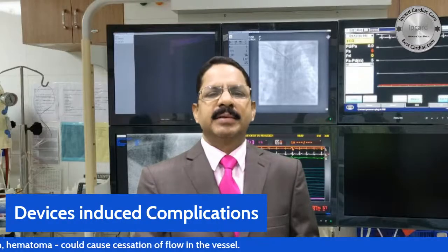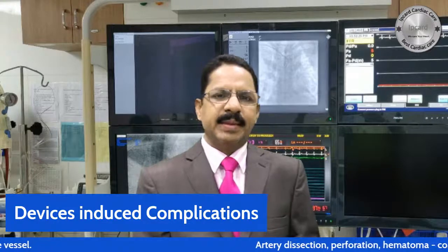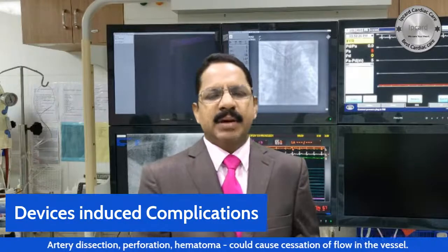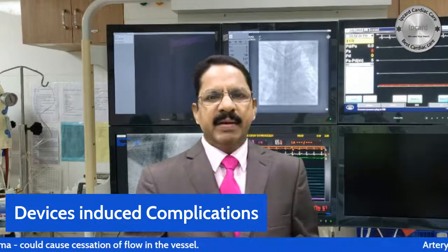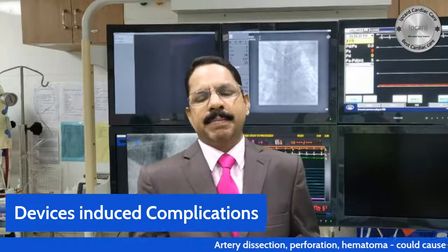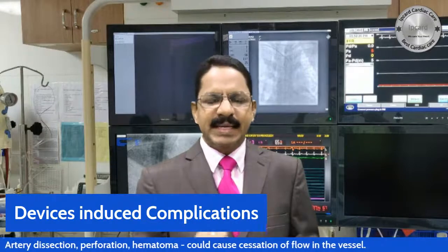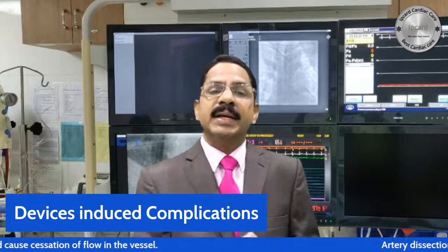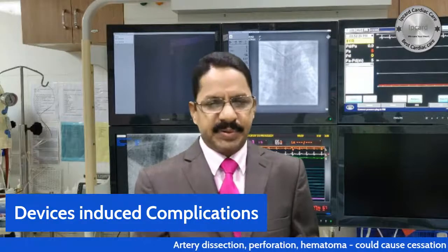Sometimes the wire which we are passing through the catheter for angiography can also cause dissection or injure the vessel wall. With device related complications, we will immediately come to know. The patient may feel sudden leg pain or arm pain, wherever the vascular site we prefer, they may feel a little pain. But immediately all the consultants get alerted, they look into the area and the reason for the pain, and they try to clear it. So no need to fear. Again, why I'm telling this is because this is a very safe procedure.